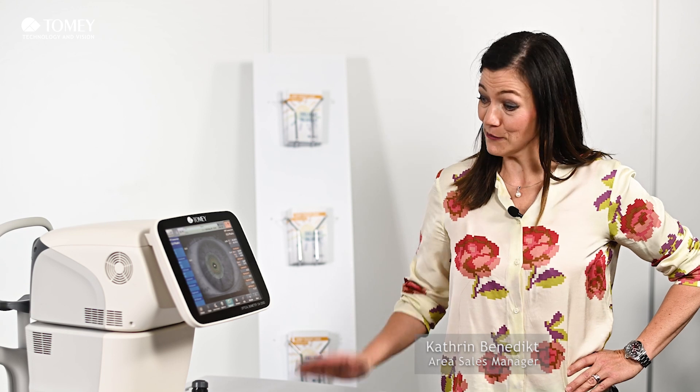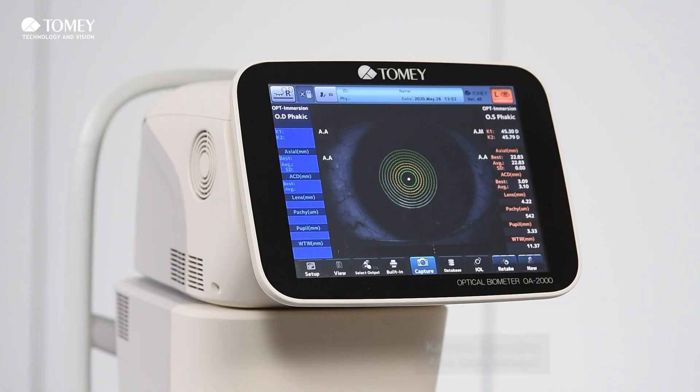Hello and welcome to our new YouTube channel from Tomei. My name is Catherine and I'm going to show you today our new optical biometer. This new optical biometer gives you a lot of features which I want to introduce you today.